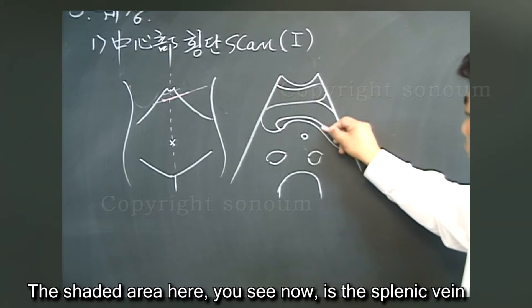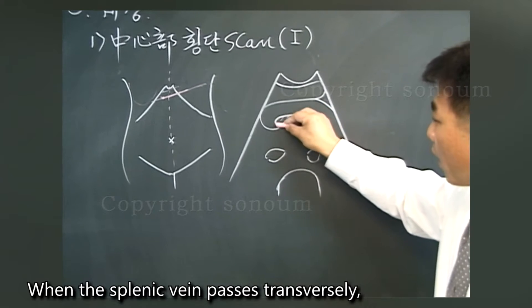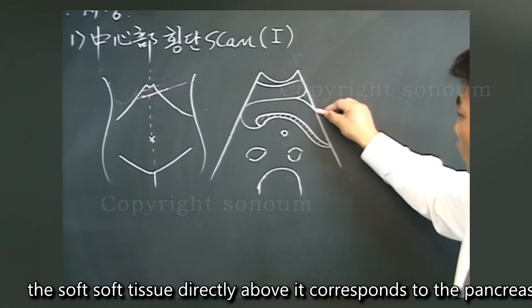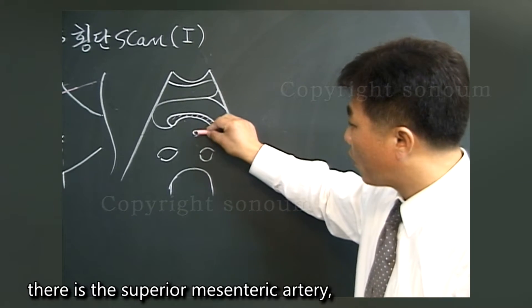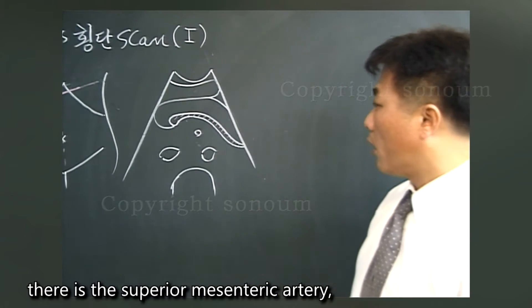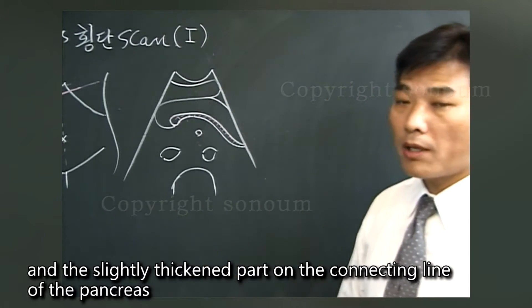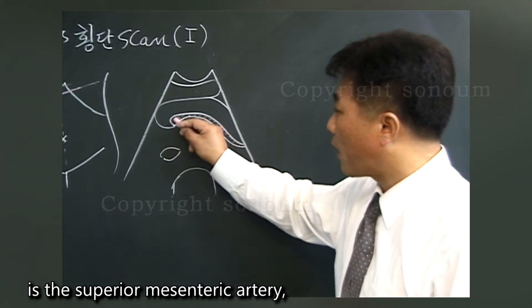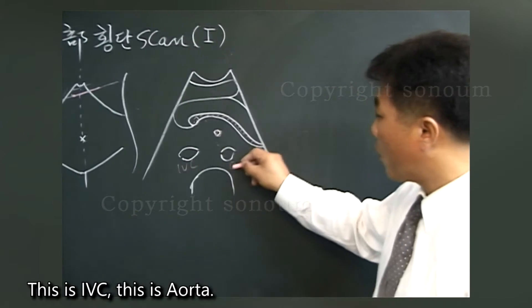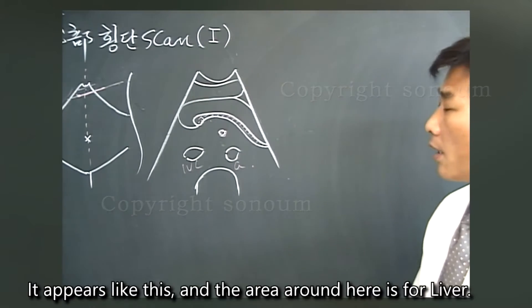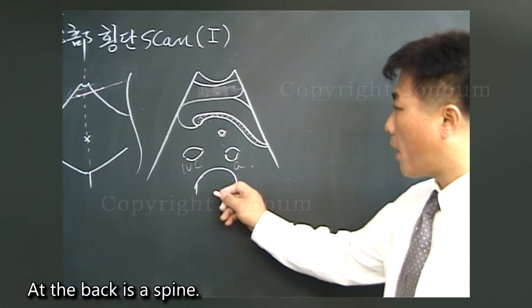The shaded area you see now is the splenic vein. When the splenic vein passes transversely, the soft tissue directly above it corresponds to the pancreas. At the back of the pancreas there is the superior mesenteric artery, and the slightly thickened part on the connecting line of the pancreas is the superior mesenteric artery and the superior mesenteric vein. This is the IVC, this is the aorta, and the area around here is for liver. At the back is the spine.